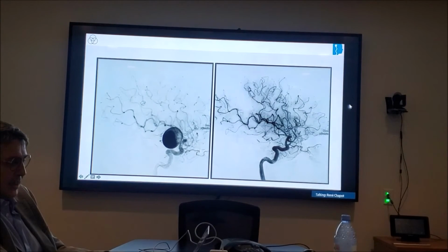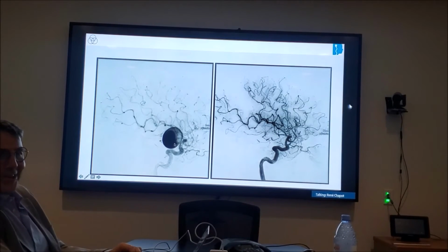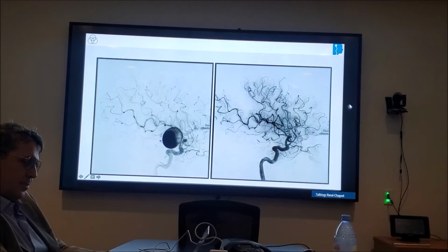This is a complication that I created. I treated this aneurysm with a flow diverter, and I did even something more. And I lost here a part of thrombus. The aneurysm is just occluded, but also a branch. And, well, you don't want to create an embolus, knowing that this patient has dual antiaggregation, which also potentially increases the risk here.